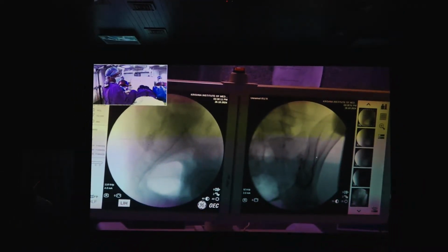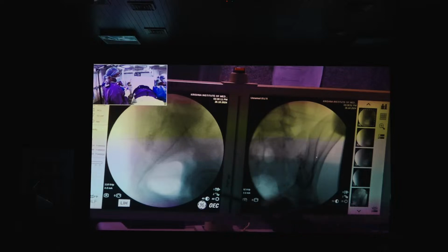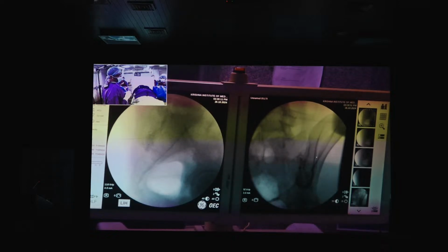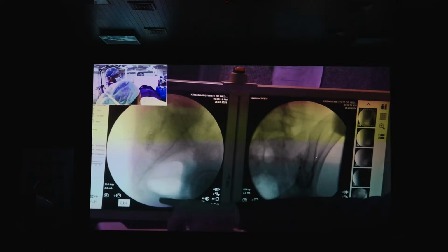As you can see, in the lateral view, the contrast takes the shape of an auricle of the ear. So as my friend Dr. Laukarmar is showing, the auricle of the SI joint. So this whole thing is the sacrum as well as the coccyx. This is the coccyx.